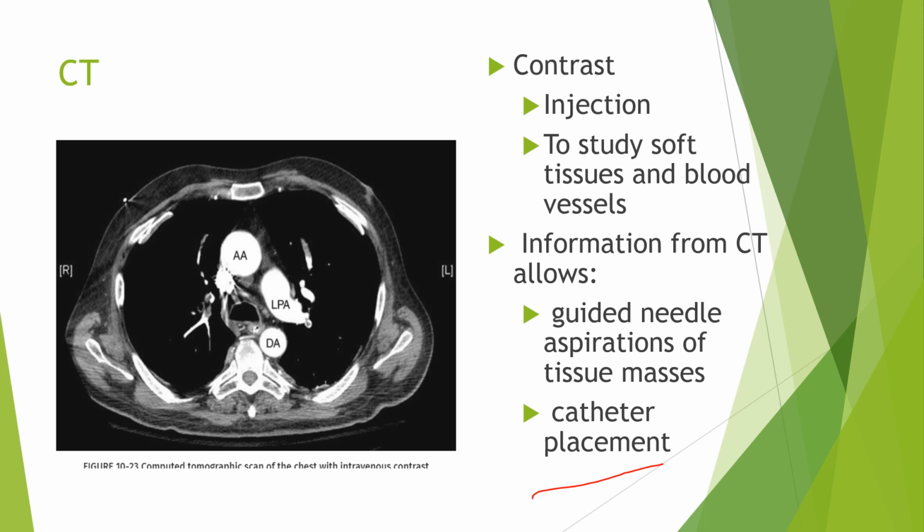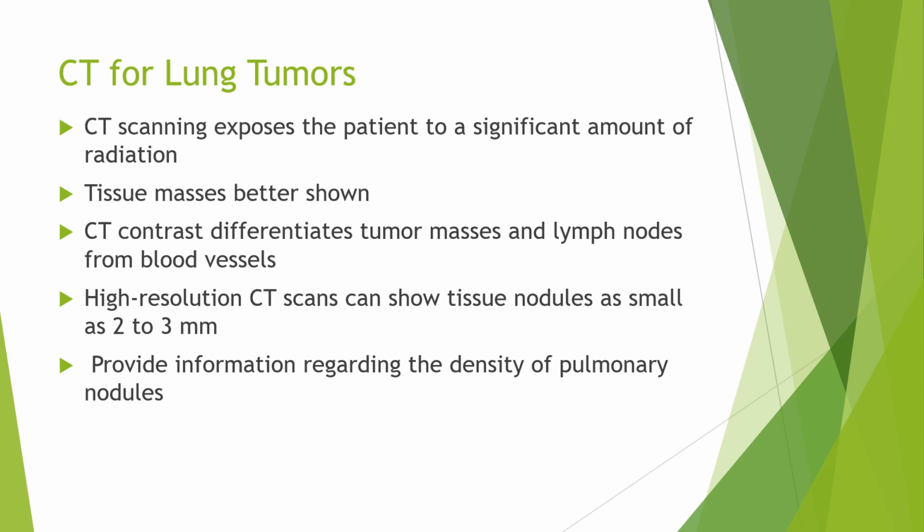It's pretty interesting stuff. CT scans for lung tumors. The thing here with CT scans, it's an X-ray, but remember it's a more powerful X-ray, so it has more radiation associated with it than your standard X-ray. Understand most patients aren't exposed to it day in and day out for years and years. That's why we need to wear the lead and have that protective material when we're doing anything with radiology like that. With these patients, their exposure is very, very limited compared to healthcare workers. So always wear your lead there. Don't try to go without it.